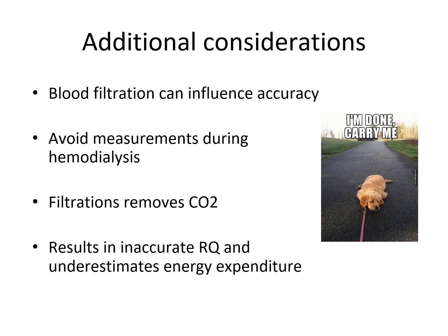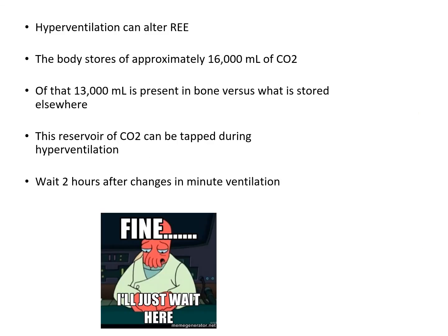Other things to consider, things that might affect the accuracy, would be blood filtration, obviously avoiding hemodialysis, because the filtration actually will remove the CO2, which then will result in inaccurate RQ and underestimates your energy expenditure measurement. Hyperventilation can also alter this.